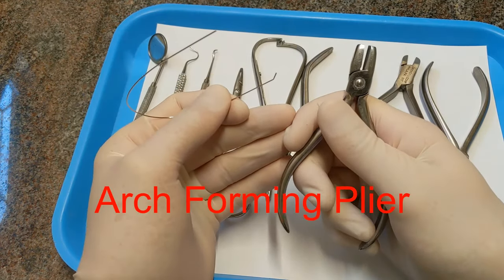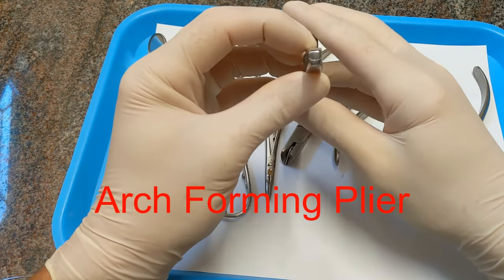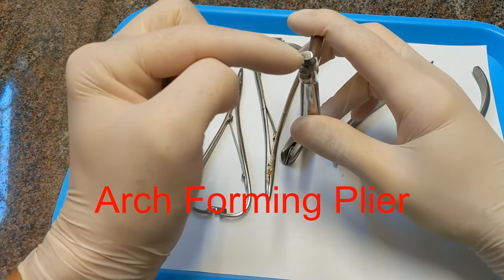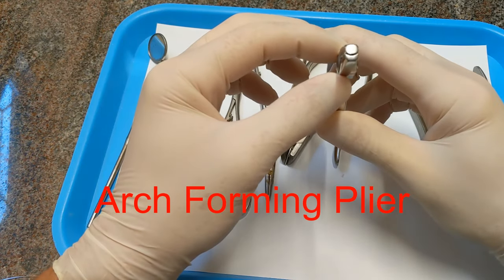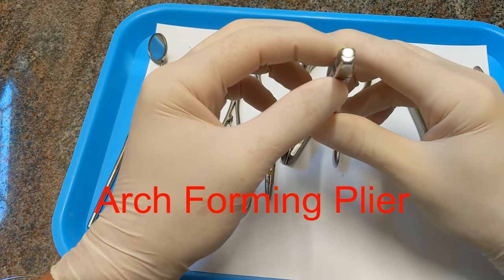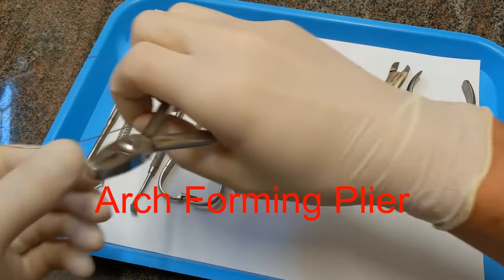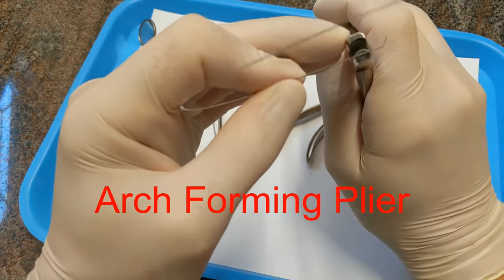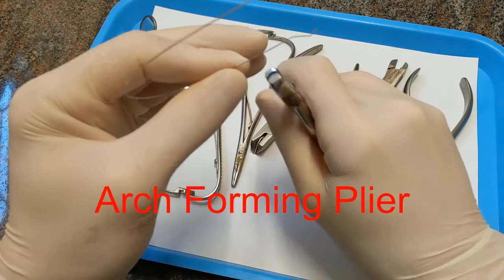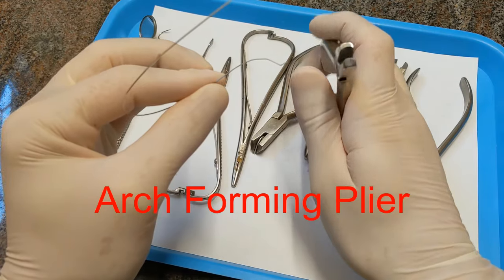This is an arch forming plier. You can tell because one side looks like a smiley face — one side is convex and one side is concave and they fit together. This is for shaping arch wires or lingual arch wires. When we place a lingual arch, we'll use this to contour the wire, placing a gentle rounded bend in it.